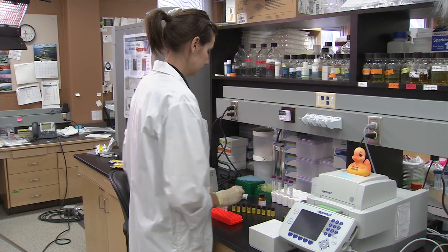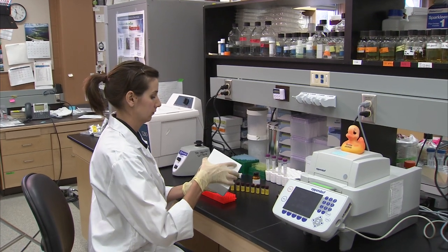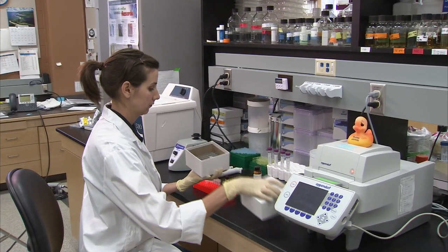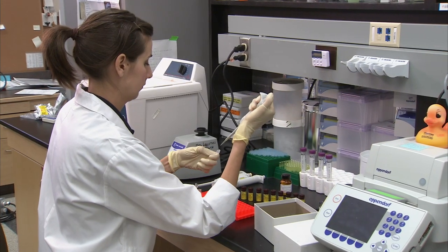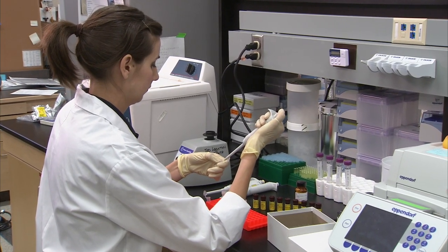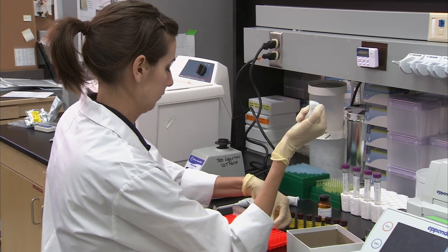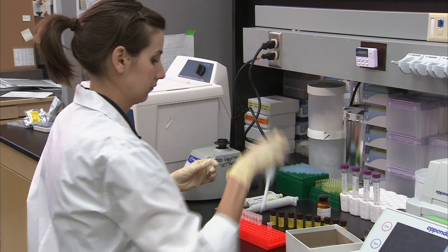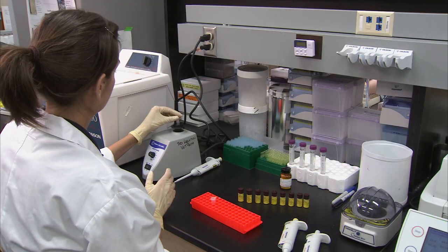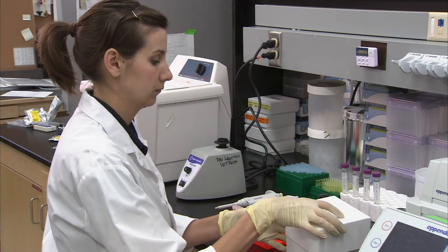Discard the EDC solution prepared earlier and prepare a fresh sample of 10 milligrams per milliliter EDC in water. Add another 2.5 microliters of fresh EDC solution to the microspheres and vortex for 5 seconds. Incubate again at room temperature for 30 minutes in the dark.